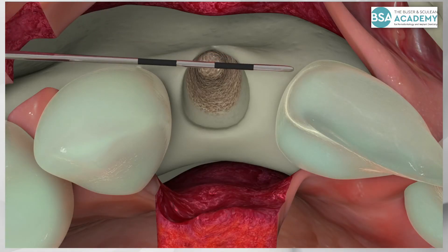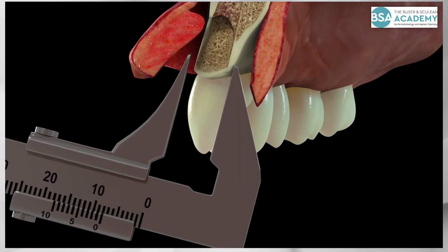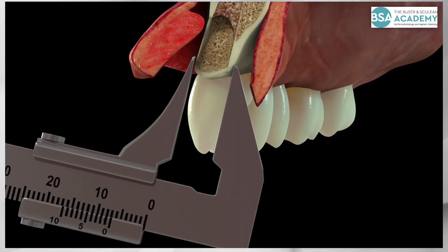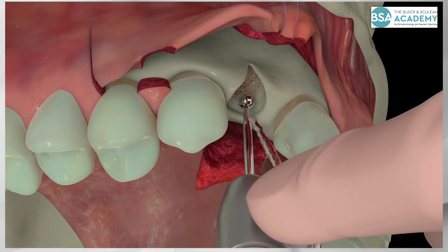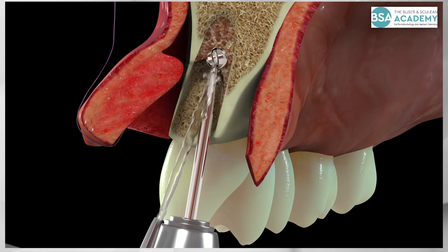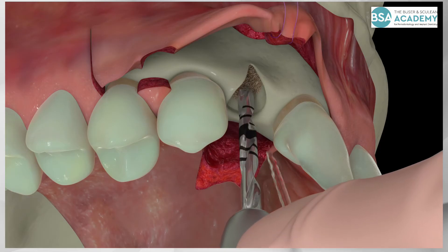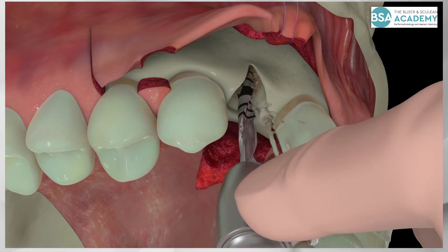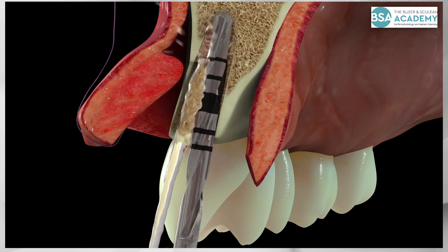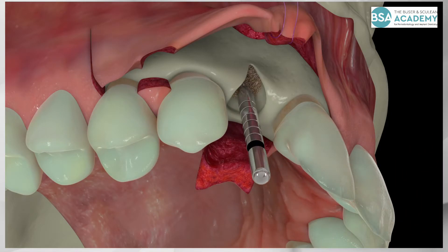The surgery continues with examination of the local anatomy using a periodontal probe. The crest width is then analyzed with a caliper, which should measure at least 6 mm oro-facially. Implant bed preparation is initiated with a number 2 round burr, preparing into the apical bone structure. This is followed by the first spiral drill of 2.2 mm diameter, using a drill speed of 800 rpm. Bone preparation is done with copious cooling using chilled sterile saline. The depth gauge is inserted to check the sink depth and the implant axis.